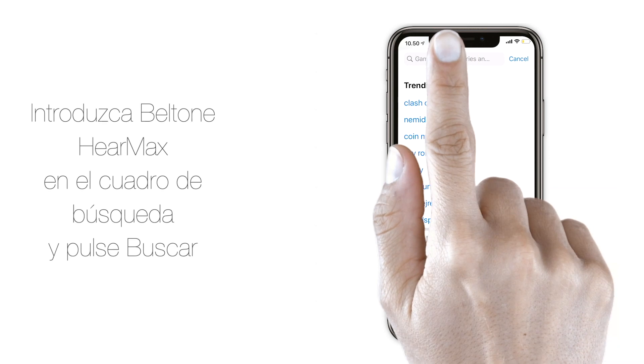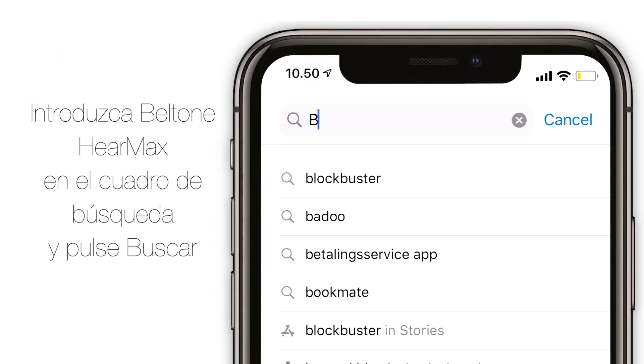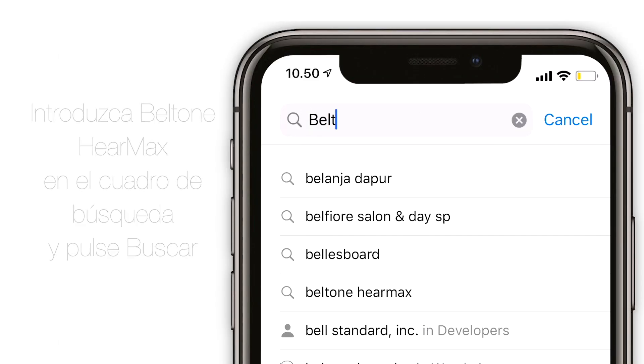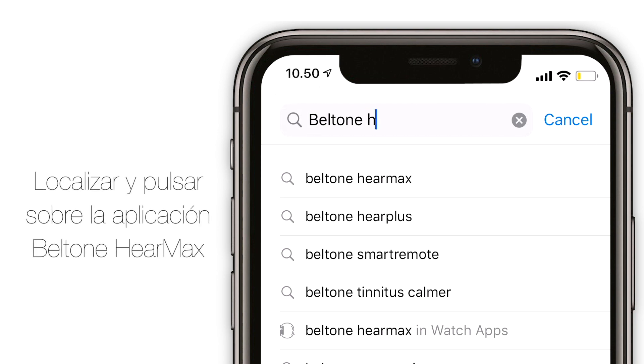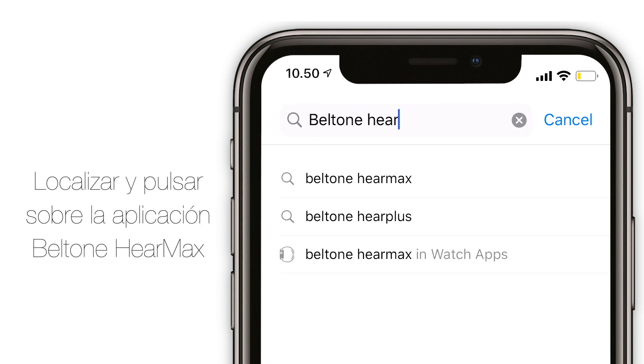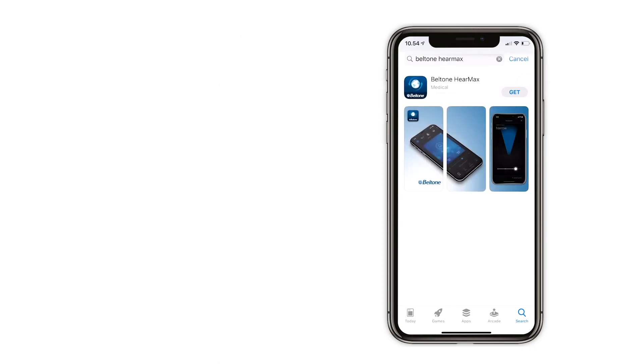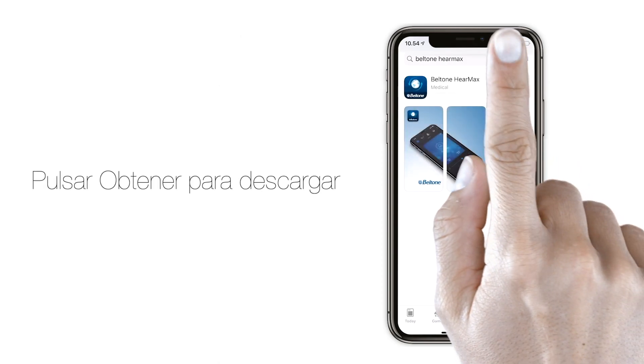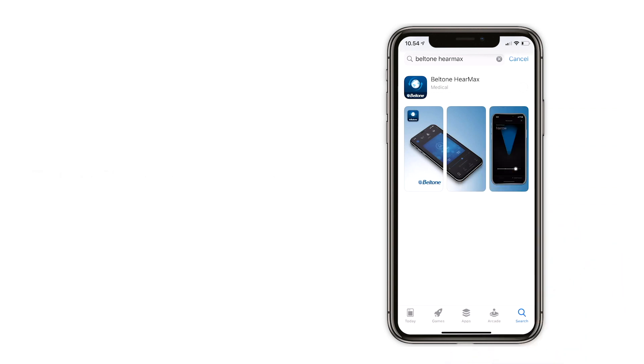Enter Beltone HearMax in the search box and tap Search. Find Beltone HearMax among the search results and press Get to download and install the app.